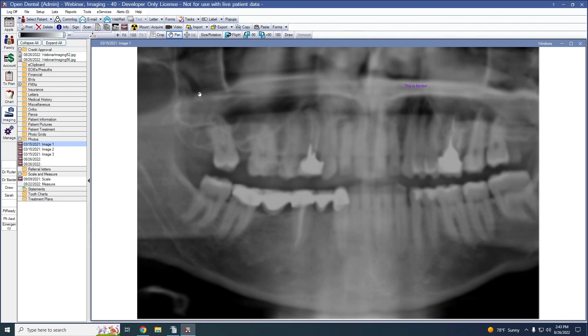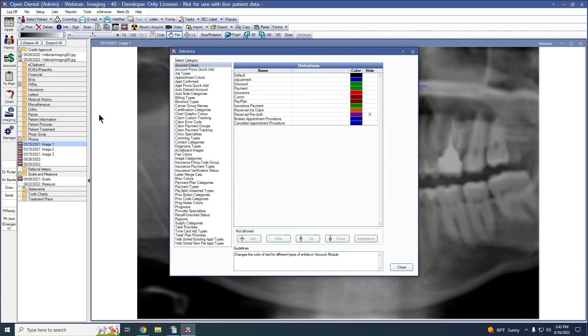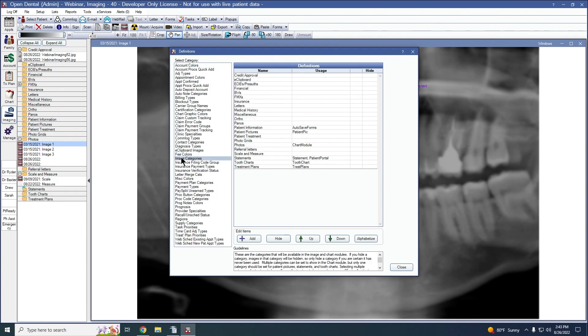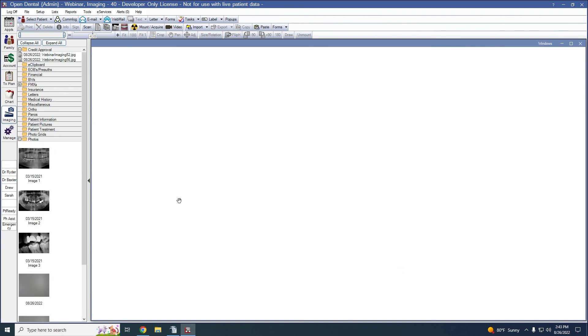The final feature we'll look at today is a new setting for our imaging categories — it is now possible to display image files as thumbnails. To set an imaging category to display thumbnails, go to Setup, Definitions, and Imaging Categories. Here we can select the imaging category that we want to show thumbnails, and then select the box for Show Thumbnails. Please note only files in an image format can be displayed as thumbnails.